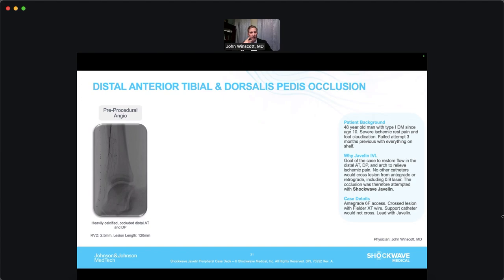It was really a stubborn lesion. Even when I locked a small profile balloon onto the wire and tried to pull the catheter through the lesion with the wire, which is usually a very successful technique, I couldn't even do that. It would just accordion the balloon at the lesion. It was really resistant. So at the time, I decided to abandon the procedure.